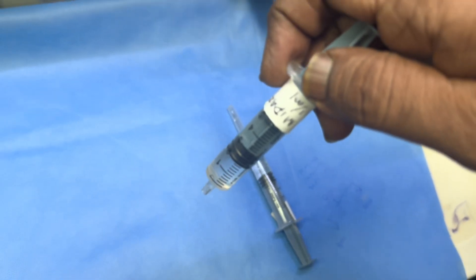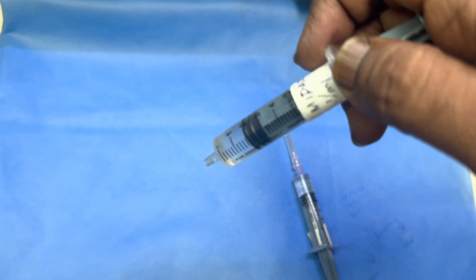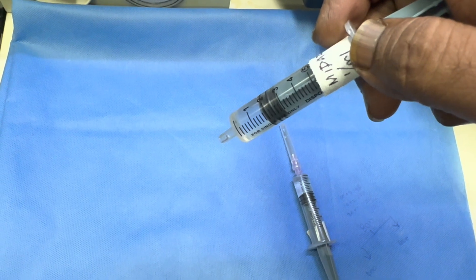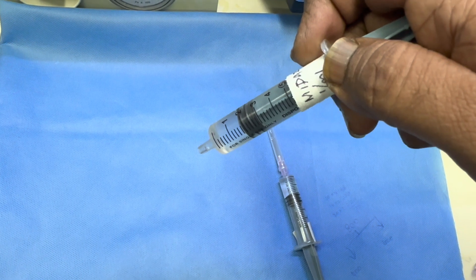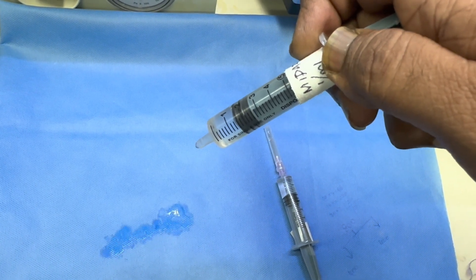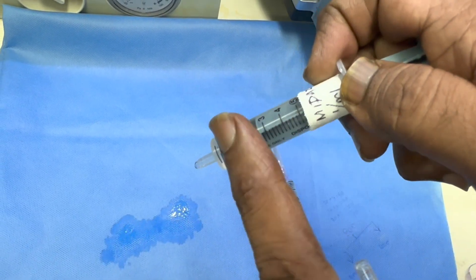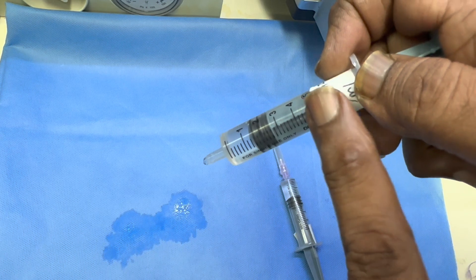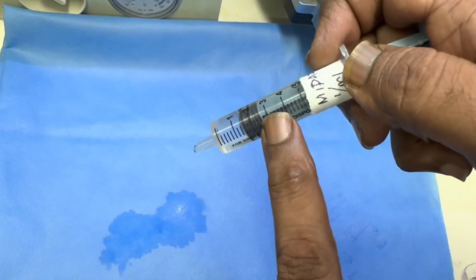Now as you start injecting, you know what drug you are injecting and you can clearly see how much you are injecting. You can see here very clearly how much you are injecting, because you can see the drug name and the measurement markings here.